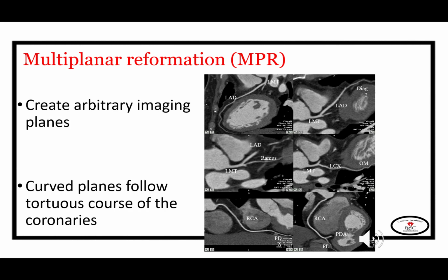Curved multiplanar reformations create arbitrary imaging planes that follow the tortuous course of the different coronary arteries, and we can see a curved non-anatomical image of the whole coronary artery in question, starting from its ostium till its end.